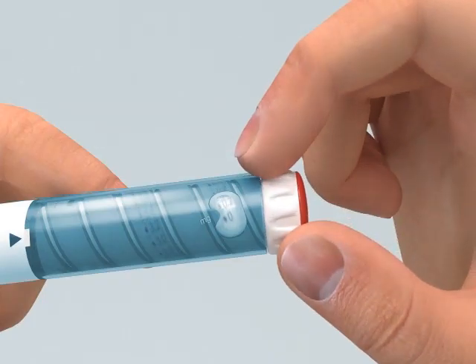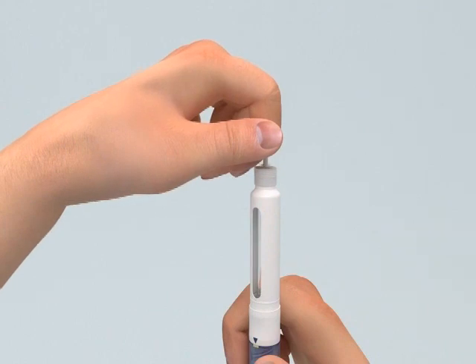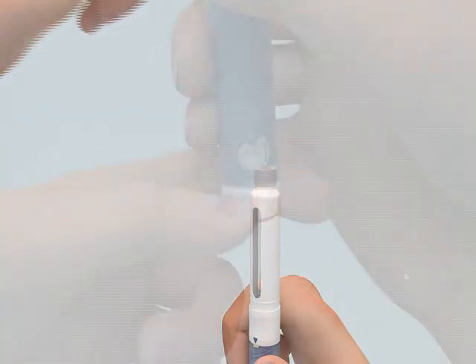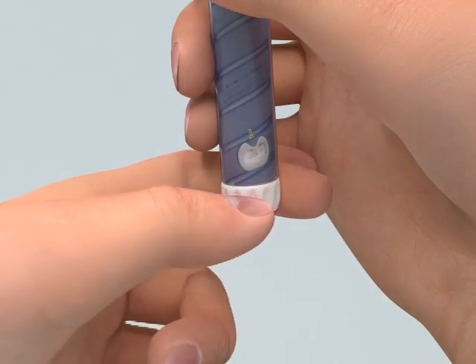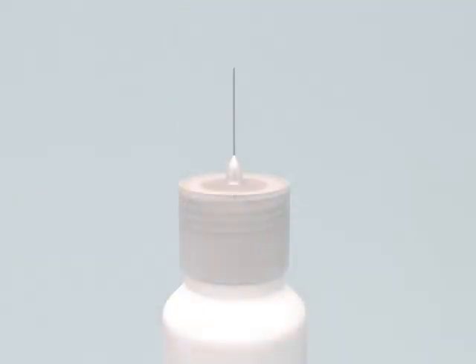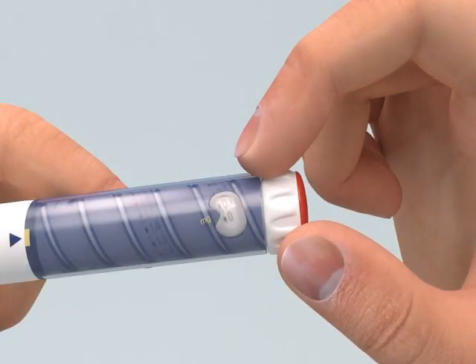Remove the inner pen needle shield. With the pen needle pointing up, firmly turn the dose knob back to the zero position and hold for at least five seconds. At least two drops of medicine must flow out of the pen needle for the pen to be properly primed. If at least two drops do not flow out, set your dose again and repeat the steps until at least two drops of medicine appear at the tip of the needle.